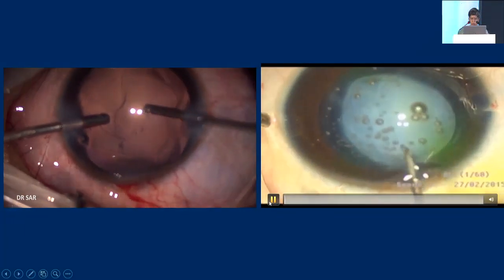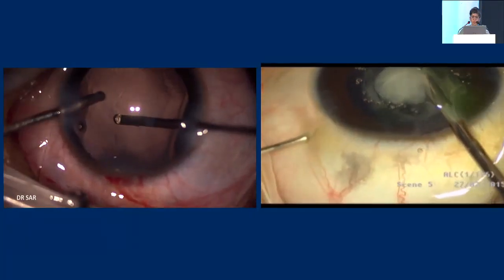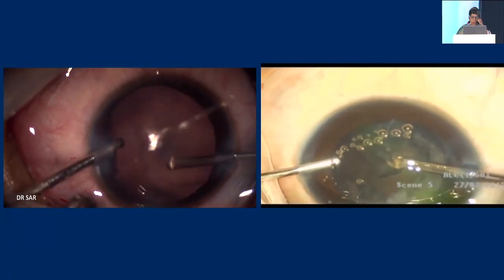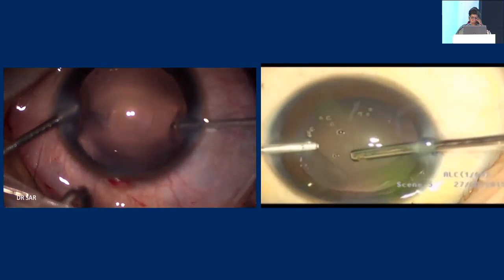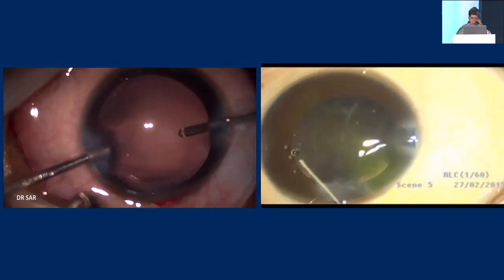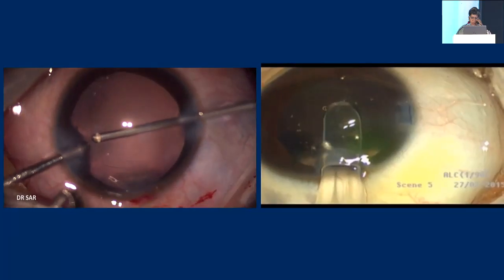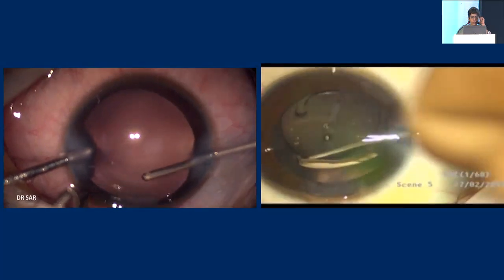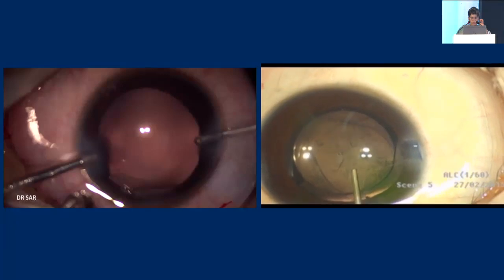Sometimes you may encounter posterior capsular dehiscence, as shown here. Since it was a little anticipated, I went with the vitrector straight away to aspirate the lens as well. You can regularize this posterior capsular dehiscence using a good OVD to place the lens very comfortably in the bag without risk of extension — if you just take away the edges where there are flaps, you can place the lens in the bag comfortably and fairly safely.